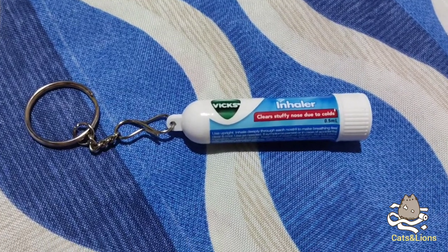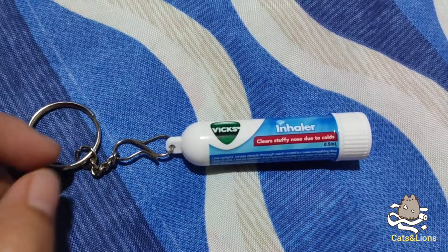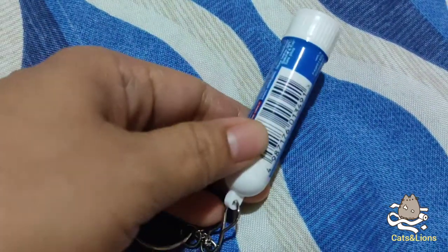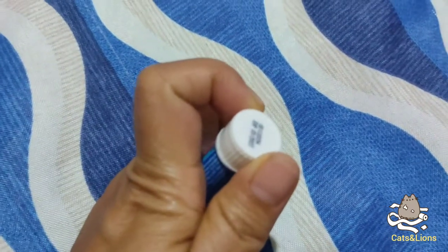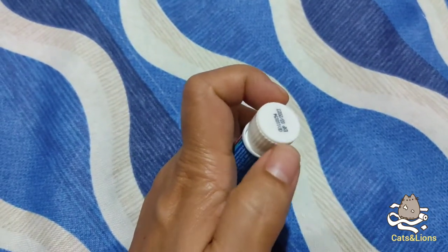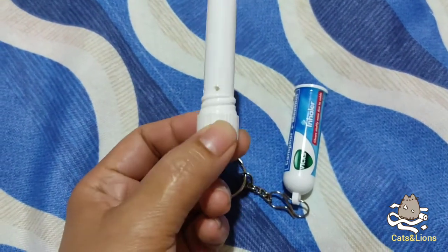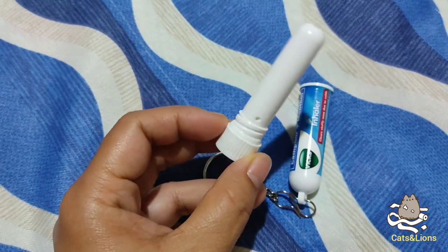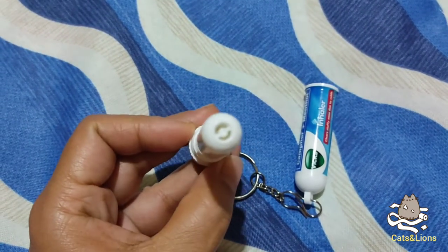If you have a stuffy or clogged nose, this Vicks inhaler delivers relief because it contains camphor and menthol. To open it, you twist the cap counterclockwise. If it's the first time you're unpackaging this, you'll need to exert more effort. Inside this tube there's actually a sphere of camphor plus menthol medication, and you inhale it.